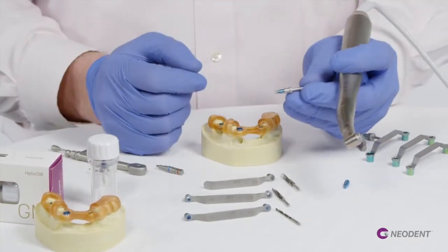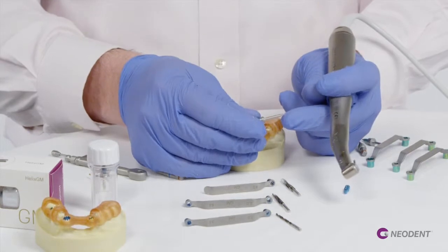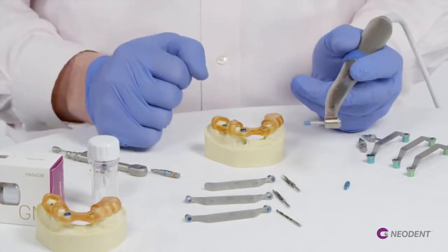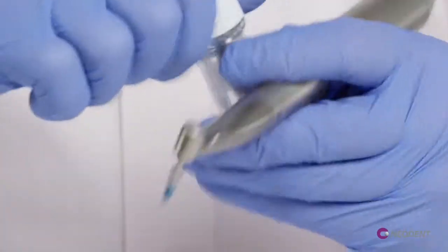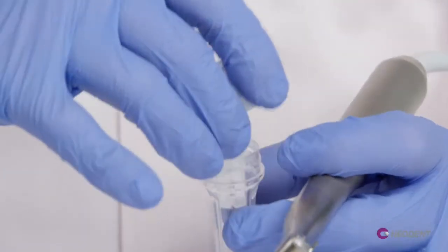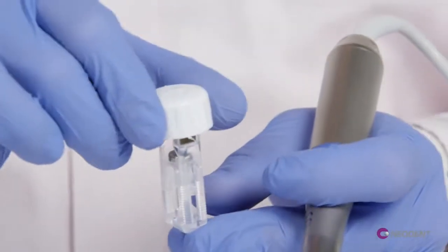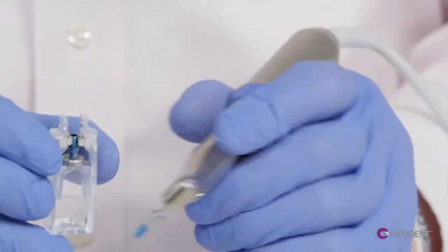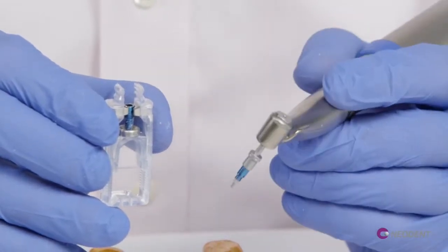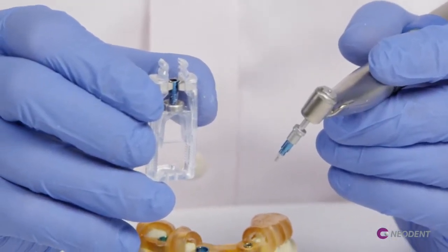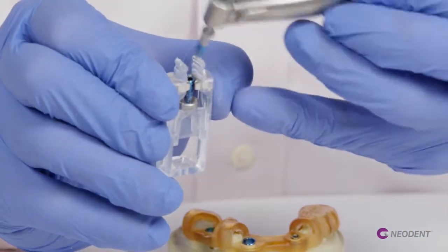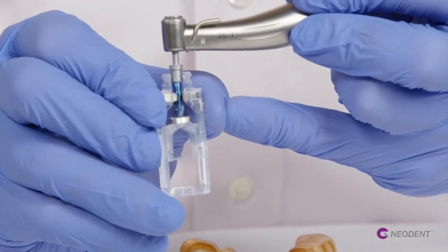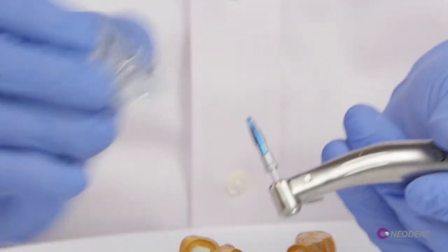Now I want to transition to the implant itself and I need to use the latch type driver. We have to use this driver because it has these wings or flanges on the side that hold our implant from the packaging. We're going to give this a half a turn and pull our implant up and out of the sleeve. We're going to do a breakaway on the top with the plastic. Our implant has these squeeze triggers on either side that are anti-rotational. I simply want to stab and grab with my implant driver and make sure that I'm flush into the implant, then remove that from the sleeve.